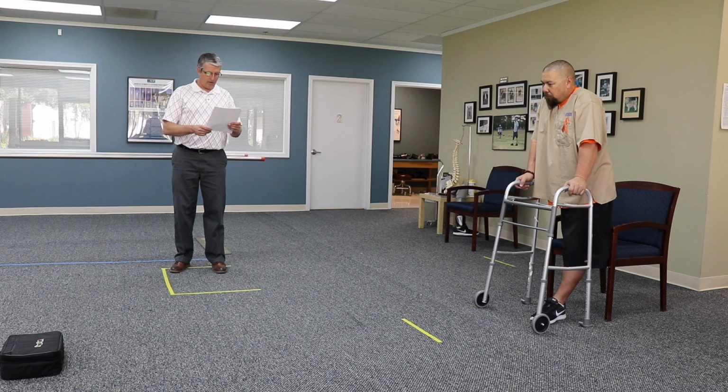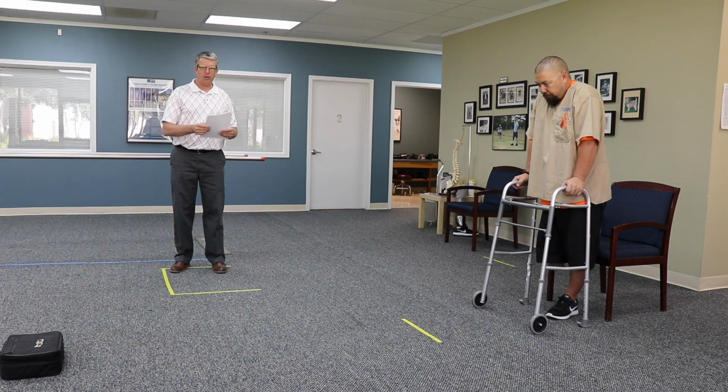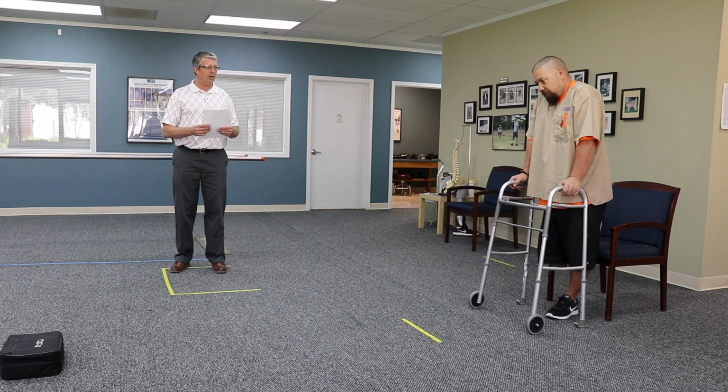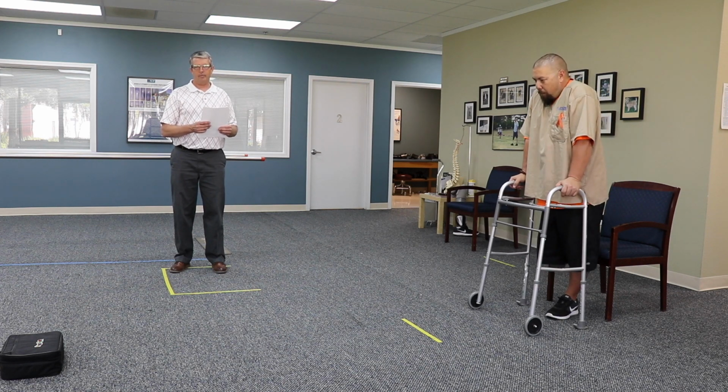Now, if somebody can't attempt it, can't step over it, they get a 0 if they're not confident in it, or if they do what Jay did, interrupt their stride or catch their foot on it, that knocks them down to a 1. But if they can't accomplish it at all, it's a 0.